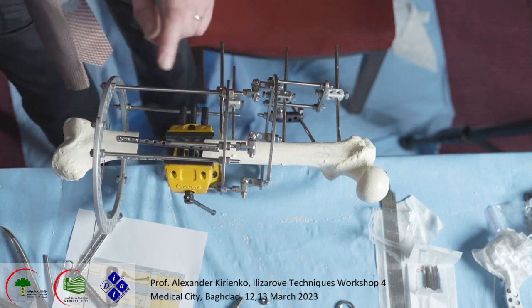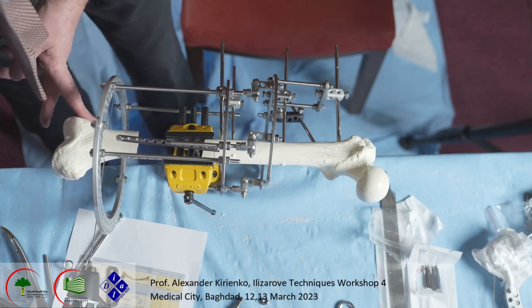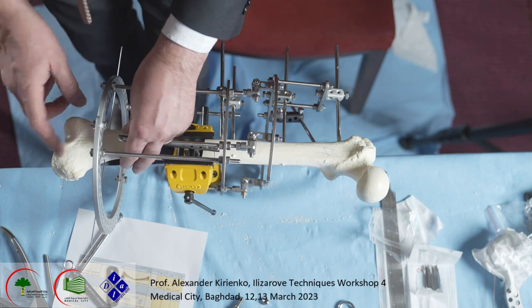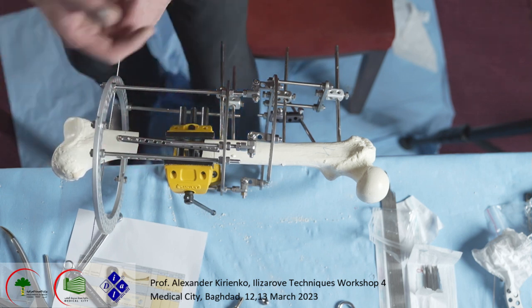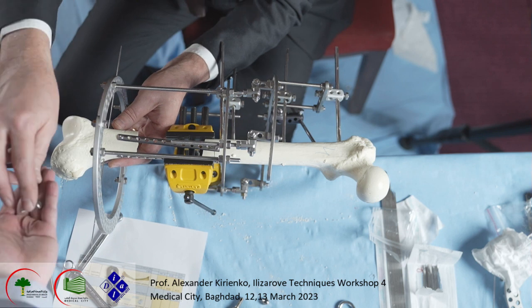You flex the knee, see the skin displacement, and you reintroduce the wire again like this. And this way you achieve good movement of the knee. Obviously, if this fragment is not stable, it's difficult to do this job, you try to do it as well as possible. Okay. Now we attach the wire.